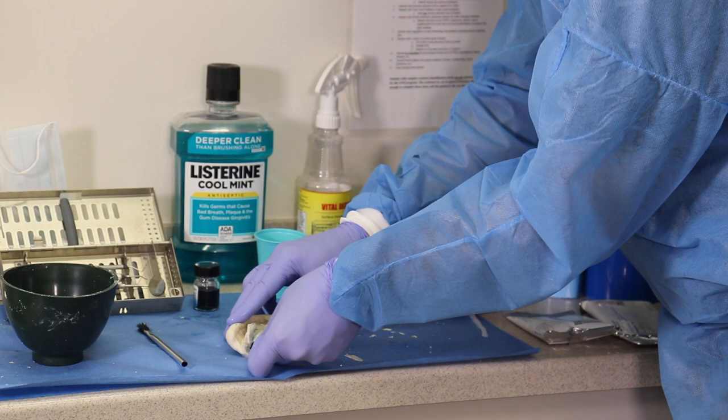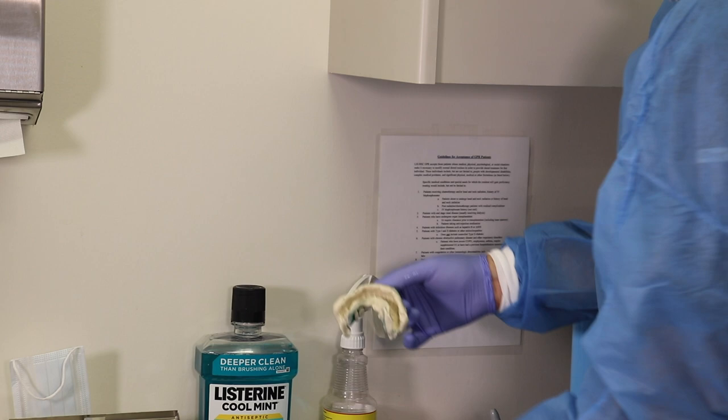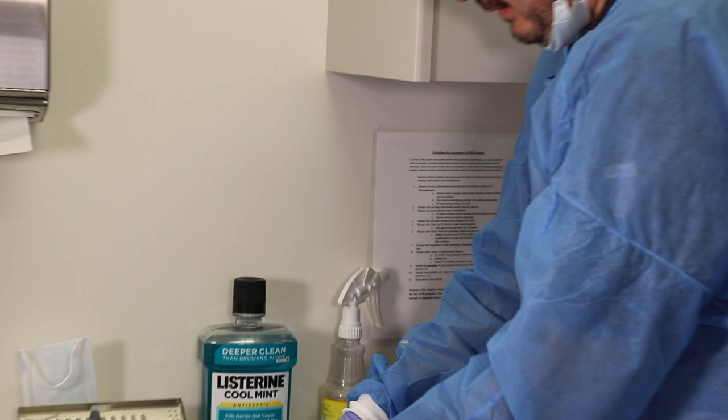Can you see there, Marco? Lift it up. So this will just fit in this space, okay? It doesn't have to fit snug. It's just going to be a support for some alginate. So let's leave it here on the table like this.